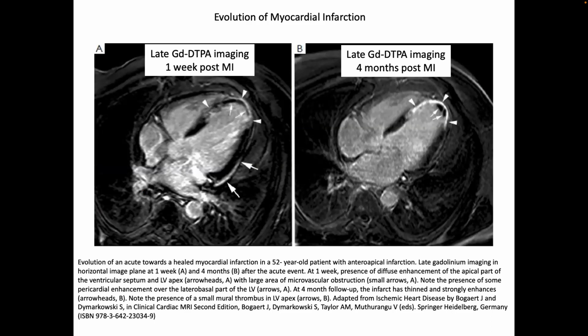The other thing when you're looking at these late gadolinium enhancement images, this is a high resolution picture of late gadolinium. You try to do it higher and higher with people, and it just doesn't get that much higher than this. But you can see details here, right? There's this endocardial thing that's not enhancing. There's stuff in the septum here that basically isn't enhancing. These dark bands in here are usually regions the blood doesn't even get to, right?